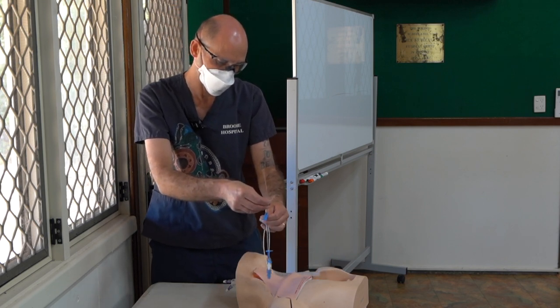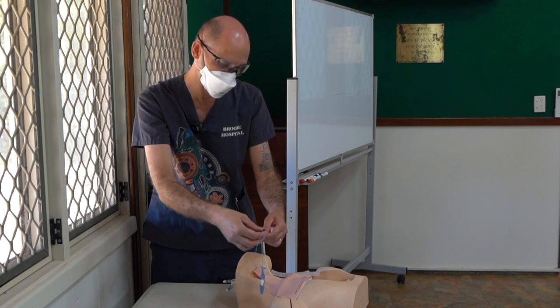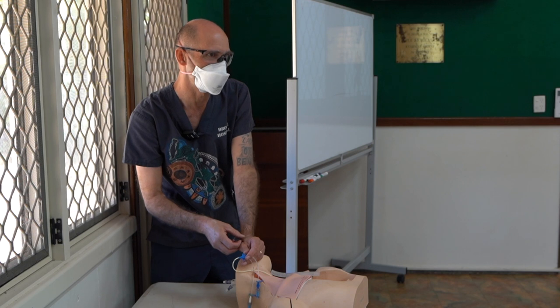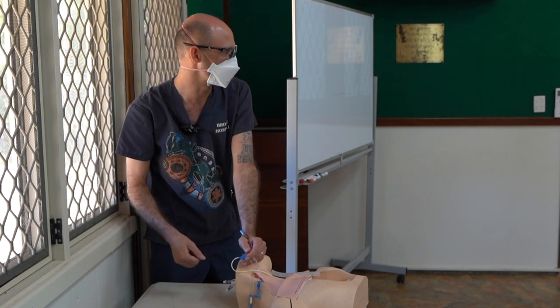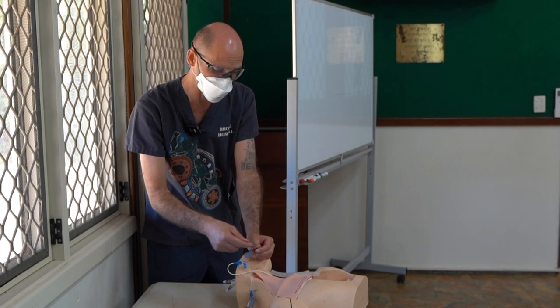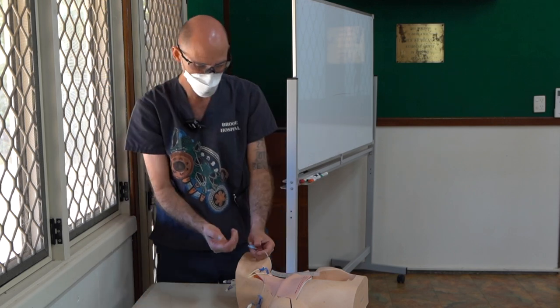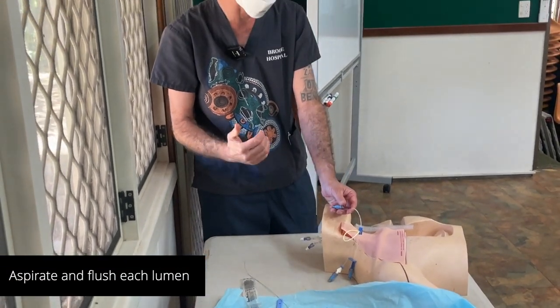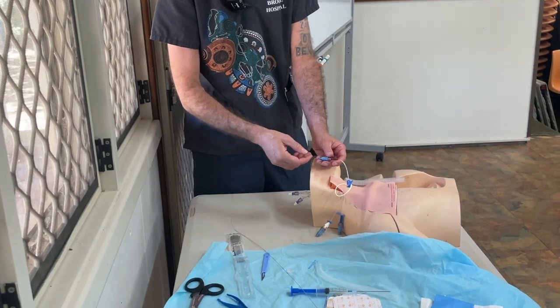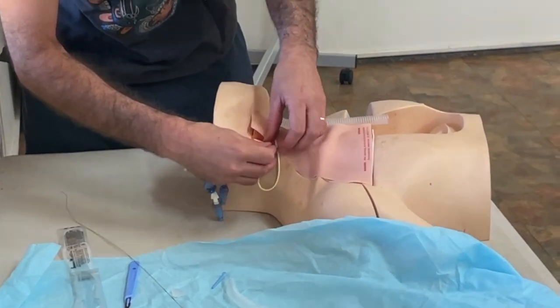When I've done that, I pull my wire out. As I pull my wire out, I might see a bit of blood coming out the back. What I tend to do is, as it comes out, fold it over and kink it off. Why? Air embolism. You can suck air in — air can go into here and cause an air embolism. You really don't want open ports exposed to open air. So as soon as that wire's coming out, I kink it over, put my bung on, and I'm done.